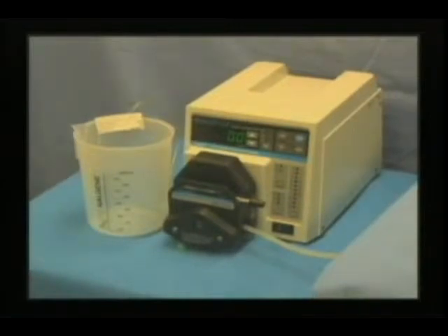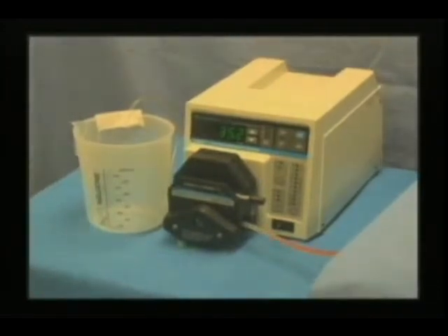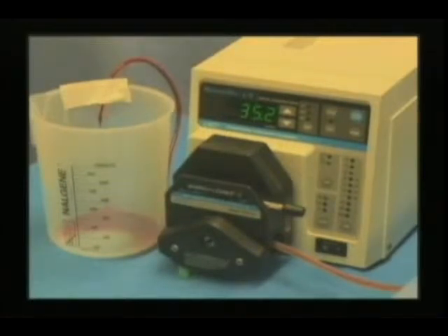We'll begin the bleed by bleeding through the femoral artery. 50% of the total blood volume in this pig will be removed over a total of 16 minutes. We remove it with a peristaltic pump to simulate an ongoing blood loss over 16 minutes. Then we'll turn off the pump and we'll wait about 5 minutes until the pig re-equilibrates, and then apply the ResQGuard to demonstrate its effect. During the course of this 16-minute bleed, approximately 900 cc's of blood will be removed.